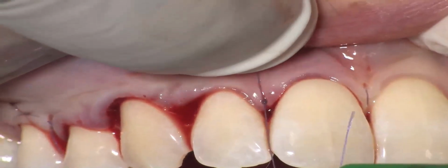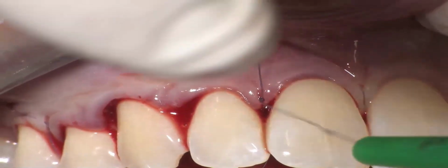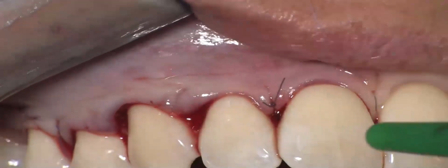So that also the small gingival recession on the lateral is completely covered.